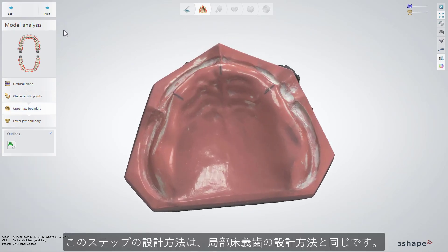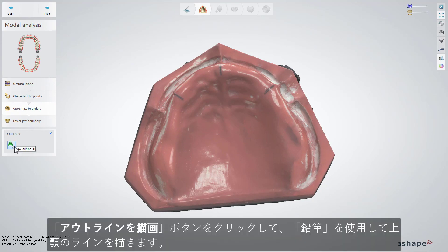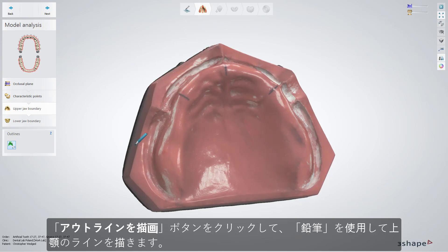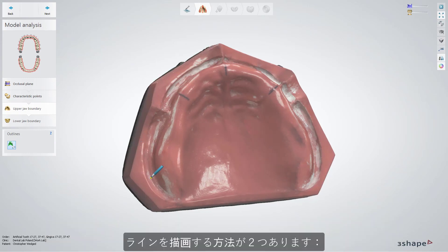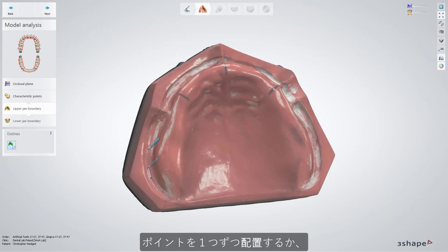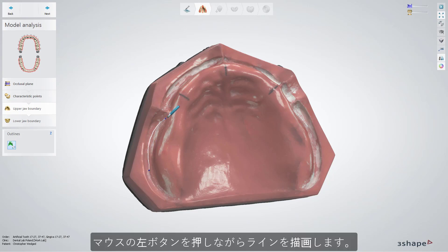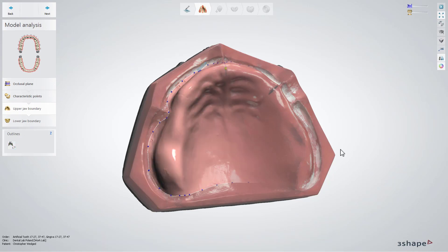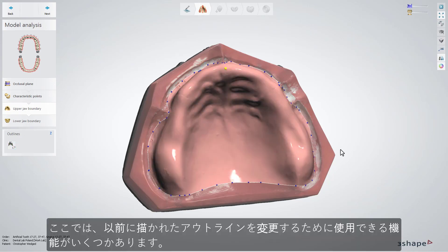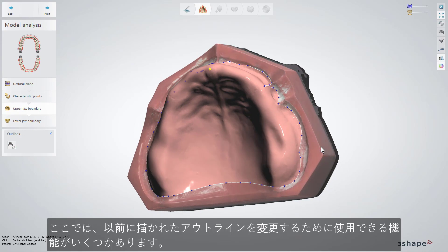This step is similar to the one while designing RPDs. Select the Draw Outline button and then use a pencil to draw the lines for the upper jaw. You can do it in two ways: either by placing points one by one, or holding the mouse button and drawing the line simultaneously. There are a few more options here which you can use to modify a previously drawn outline.